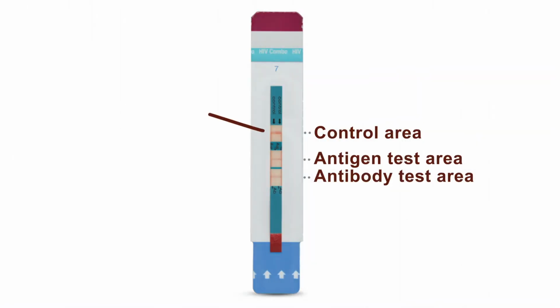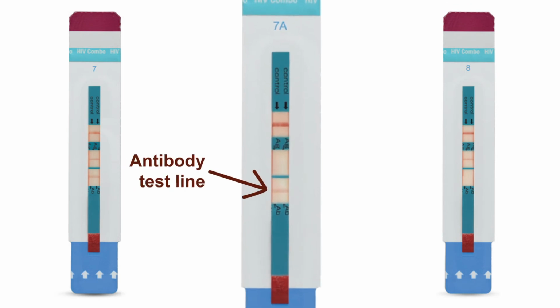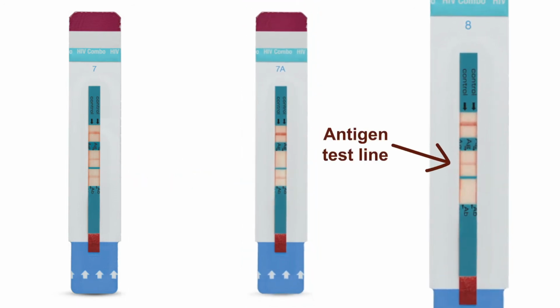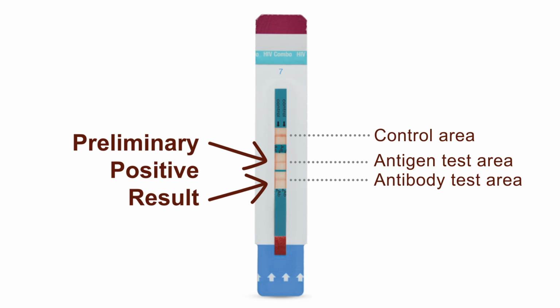To read the results, look for a line in the control area. This shows the test works correctly. Now, look for an antibody test line in the lower test area. A line in the antibody test area indicates an antibody reactive result. Then look for an antigen test line in the upper test area. A line in the antigen test area indicates an antigen reactive test result. If a line appears in either the upper test area or the lower test area, it's a preliminary positive result. All preliminary positive results should be confirmed with a follow-up test.